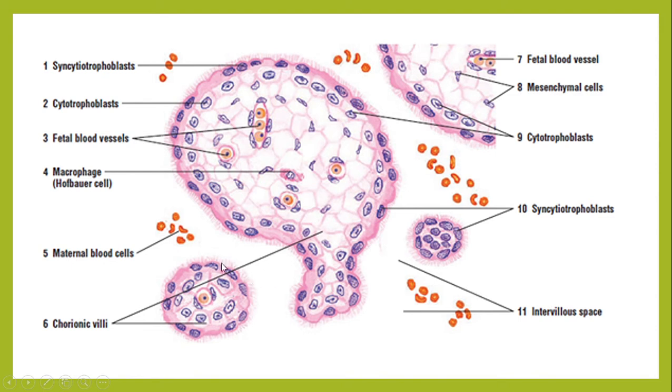And this is somewhat like a full grown or tertiary villi, and here it is only starting. So we can see different stages of villi, because the villi have a tree-like appearance, isn't it? There are different branching patterns, so in a section we can see different stages of developing villi.